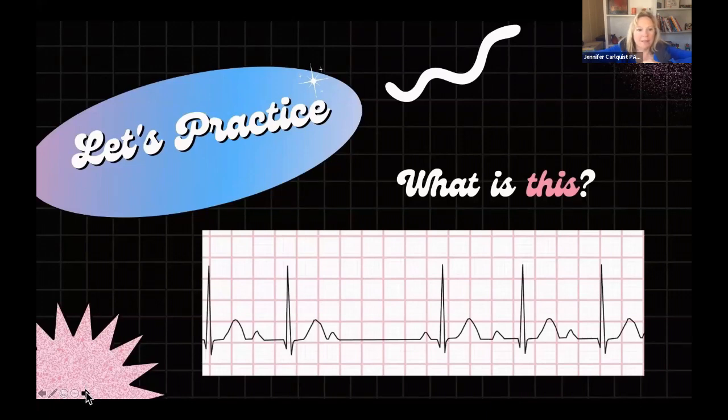Okay, so lengthening, but consistent is first degree. Lengthening, lengthen, drop is second degree type 1. And then consistent PR with dropped is type 2. Okay, good job, you guys.